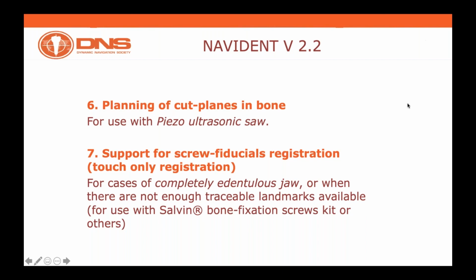And that takes place soon before the patient scanning, but with a protocol which really removes any problem or difficulty for both the surgeon and the patient.